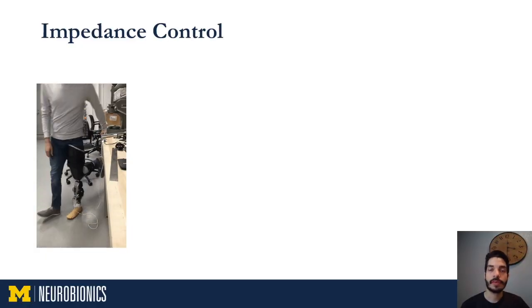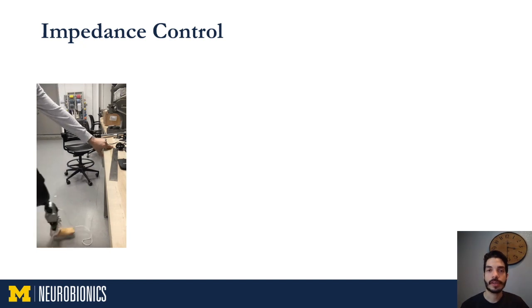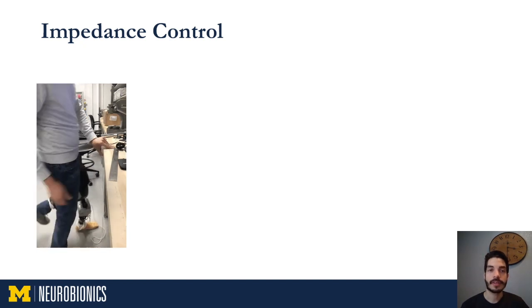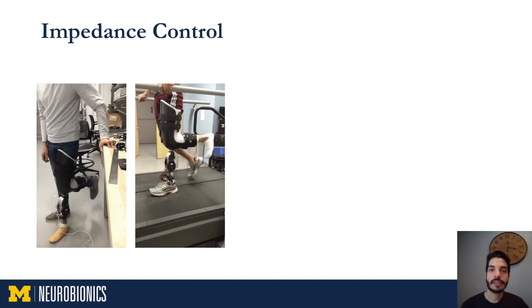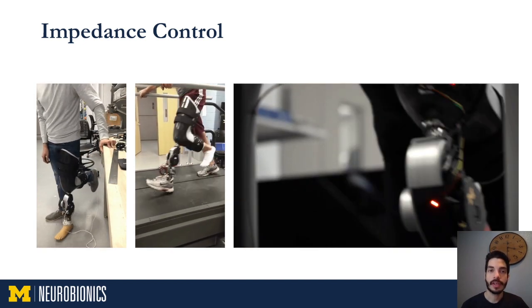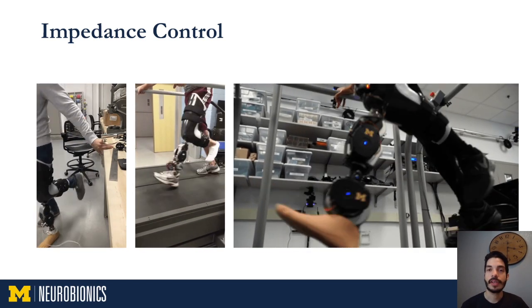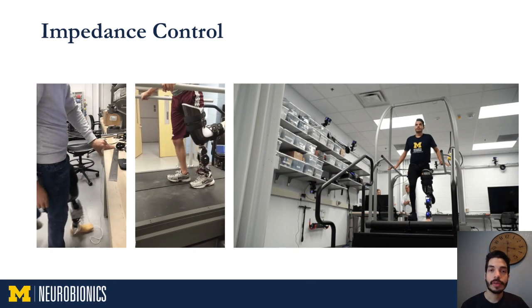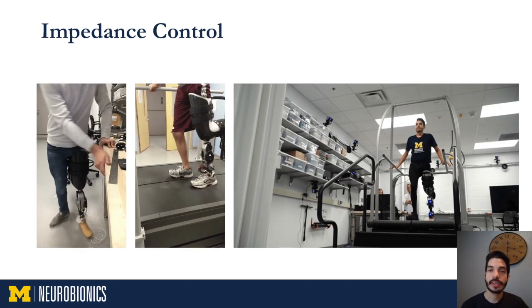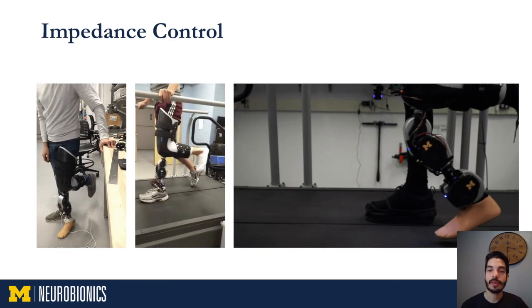Here are some videos of what the tuning process looks like. In this first video, we simplified the state machine to only have stance and swing states. In the second video, we see a poorly tuned state machine that allows for some walking on the knee. Finally, after careful tuning of all impedance and transition parameters, the leg is capable of recreating human-like walking. Note that we always test new controllers on able-bodied subjects first, and we use an adapter that locks the knee back to simulate an amputation.